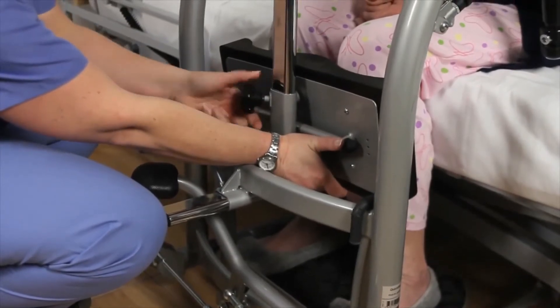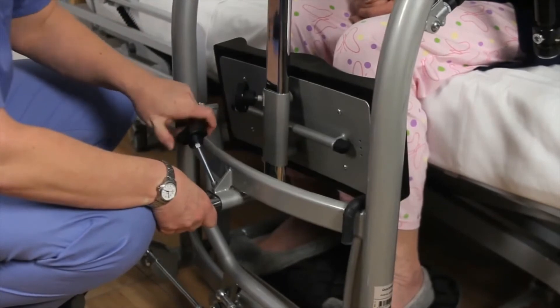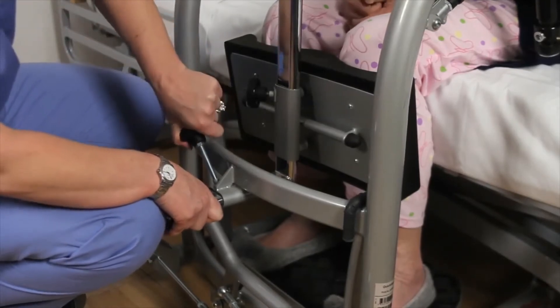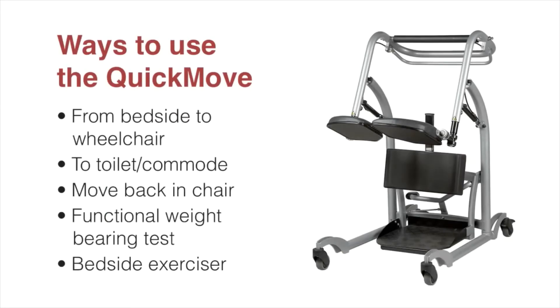To adjust the shin support, turn the knob to the left to loosen, then adjust the shin support up or down so it is just below the knee. The shin supports can also be adjusted in closer to the patient or out — turn the lower knob to the left, adjust in or out, and then tighten to the right.